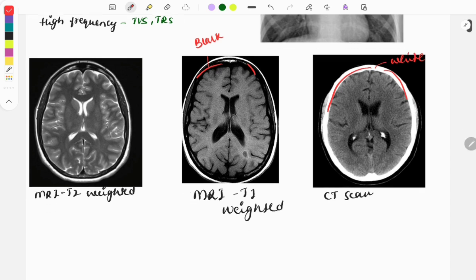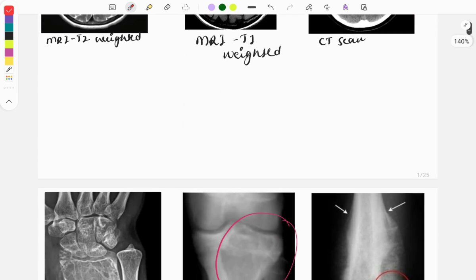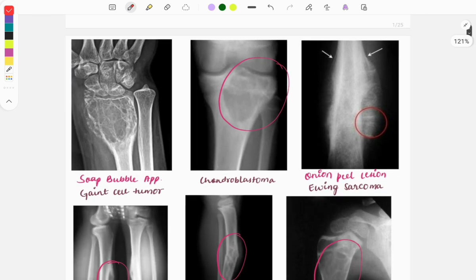On a T1 image, the CSF appears black. The gray matter will be hypointense black, like CSF, and the white matter will be white. On T2 images, the CSF is white in color; likewise, gray matter will also be white and white matter will be black or hypointense. These are the ways to differentiate between MRI and CT.